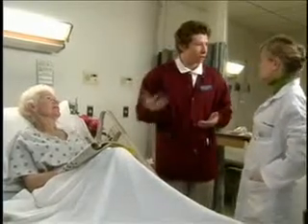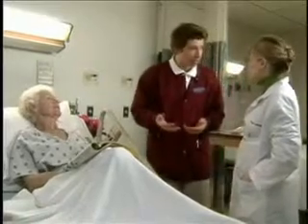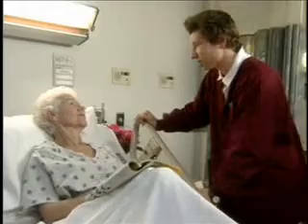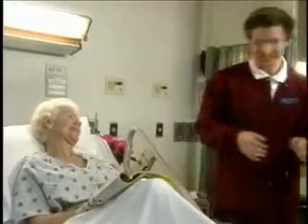Now I'll just document the procedure, noting the liters of flow per minute and the patient's response to the therapy. Great. Okay, Mrs. Keene, we're all finished. I'll be back to recheck your oxygen level now that we have you on the oxygen. Thank you, darling. You're so welcome. Thank you, Mrs. Keene. Have a good day.